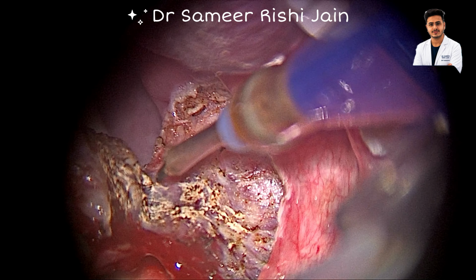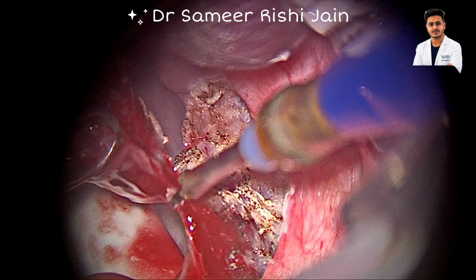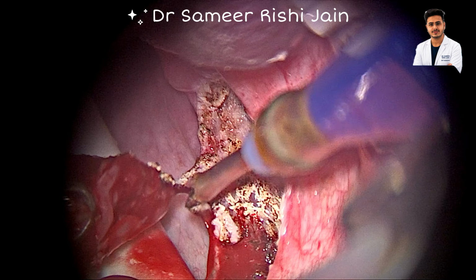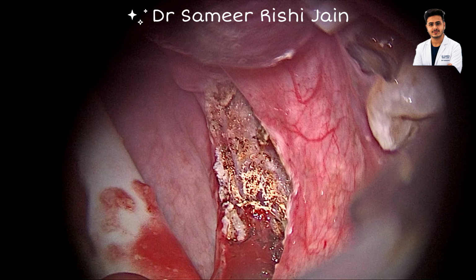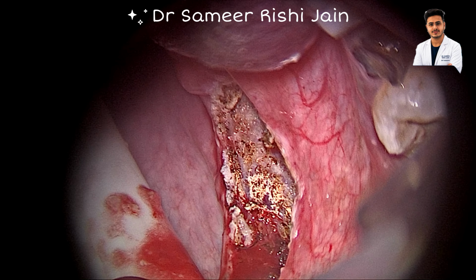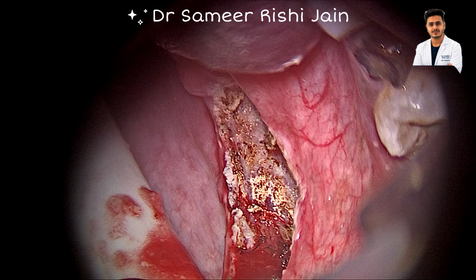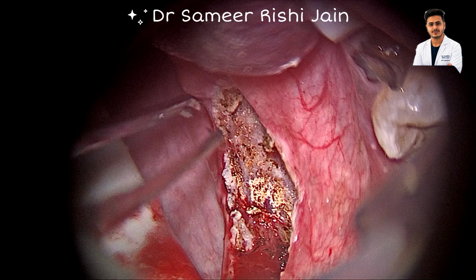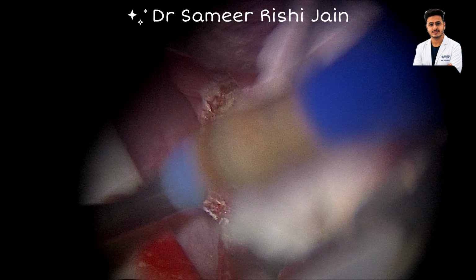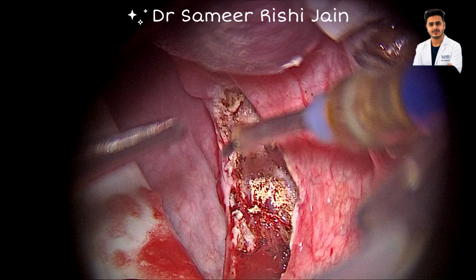You can see the bed with a good amount of fascia all around, and there is very minimal exposure of the muscle. As I have performed an extracapsular tonsillectomy, a little bit of exposure of the muscle is inadvertent. Now I will use a bipolar cautery to stop a little bit of the oozing from the bed.